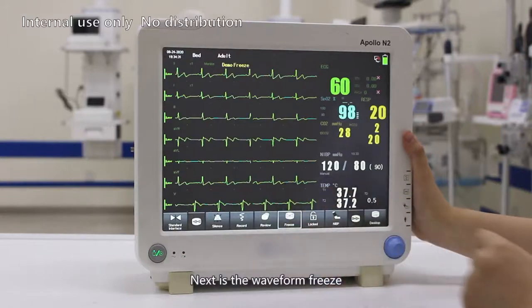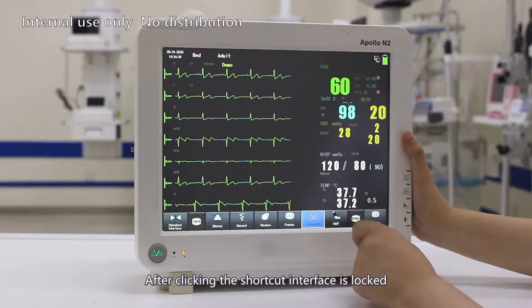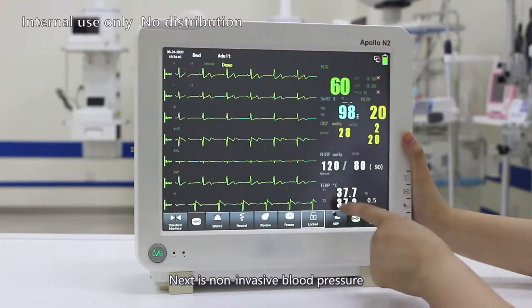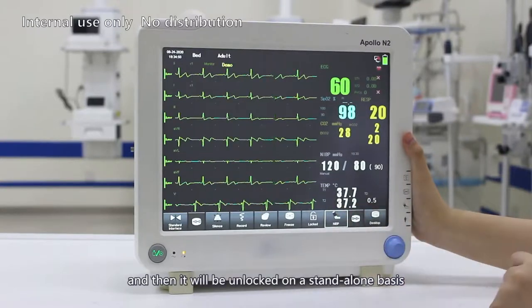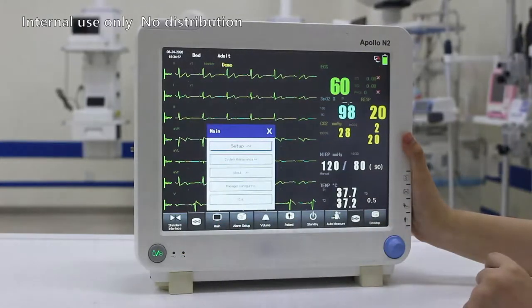Next is the waveform freeze. Next is the lock screen. After clicking, the shortcut interface is locked and cannot be clicked into. Next is the non-invasive blood pressure. Click to measure blood pressure, and then it will be unlocked on a standalone basis. Next is the main menu.